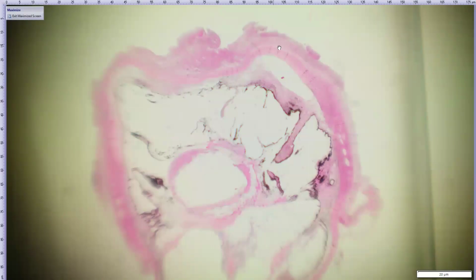So we have this broad symblepharon. And as we had seen grossly, here's our iris. It is broadly adhered to whatever is left of our cornea, but then also just directly to the conjunctiva here. So we have almost near loss of our cornea. There's been prolapse of the iris, and then just this symblepharon directly over that iris tissue. All of these little pigmented strands here and there are going to be the ciliary body plicae. As I mentioned, they're just kind of distorted due to probably this symblepharon and synechia.